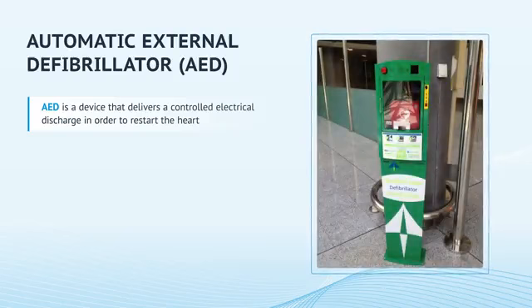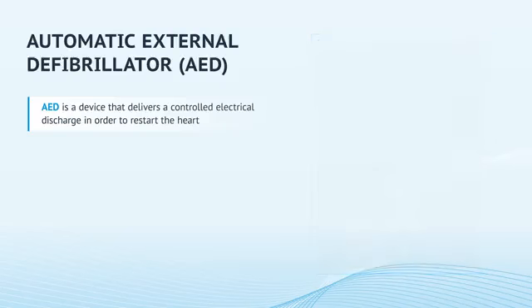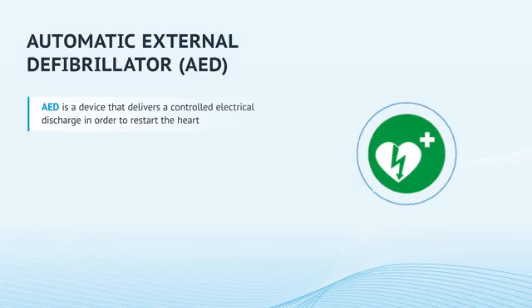Traditionally, the AED is located in public places, shopping centers, airports, schools. A common international sign indicates its location. It is a green square with a white cross in the right upper corner, a heart and lightning. When you see this sign, that means that there is an automatic external defibrillator. So let's recall the CPR algorithm and include the use of AED.